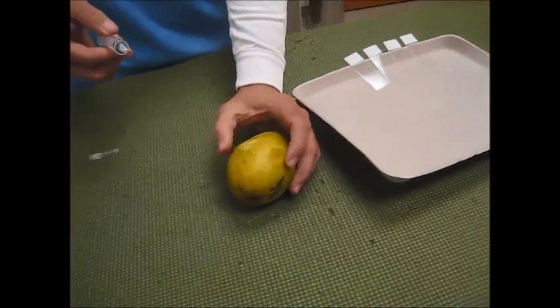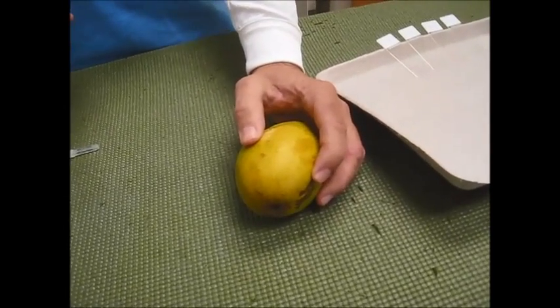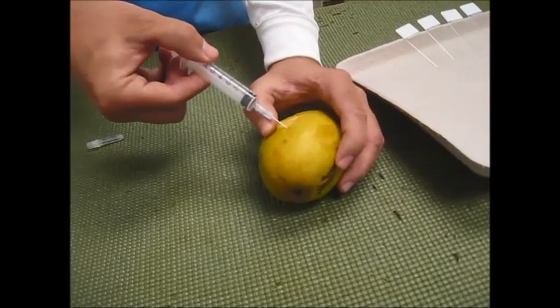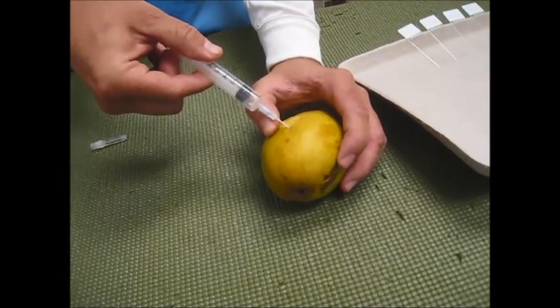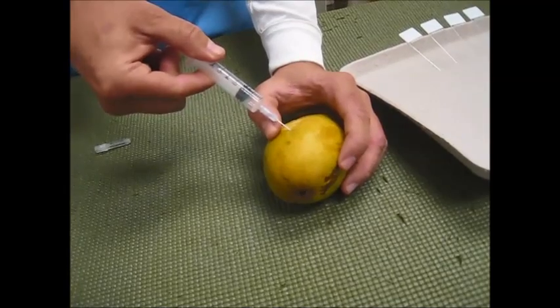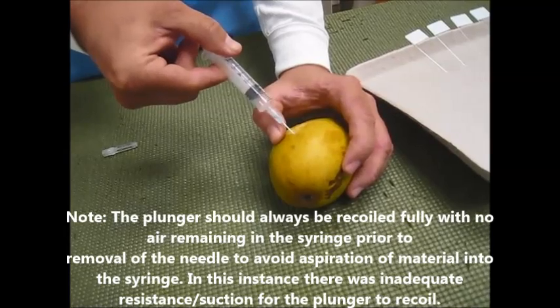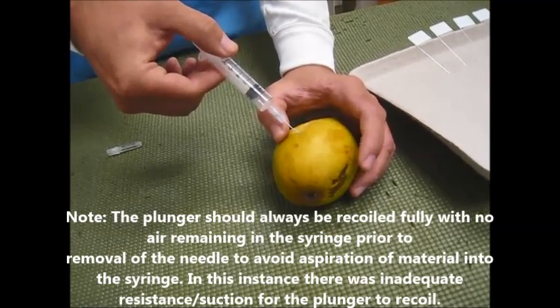Then you grasp the item to be aspirated with the plunger all the way down, insert the needle into the tissue, pull back creating a small amount of negative suction, and then gently poke changing directions to get representative material.